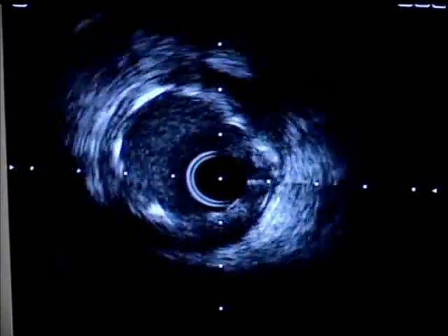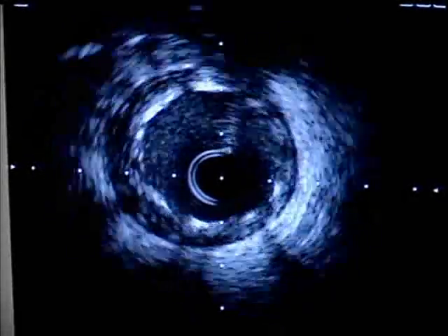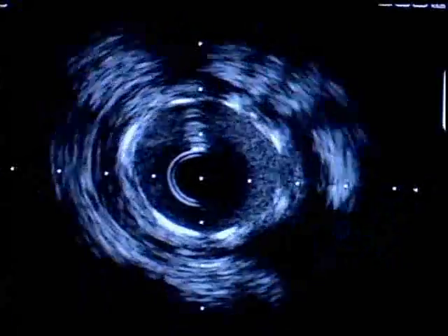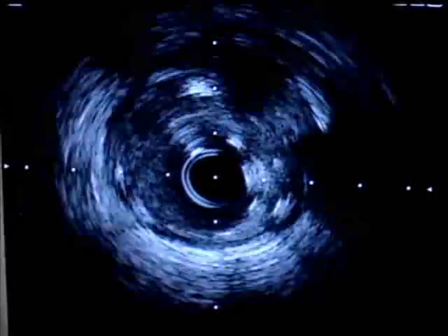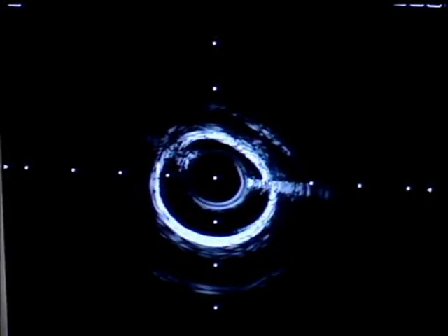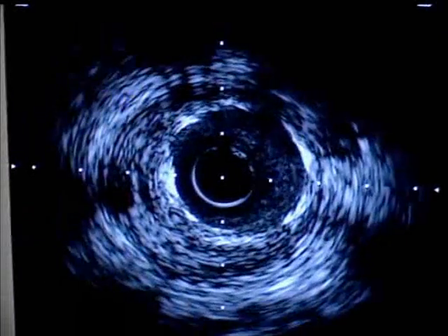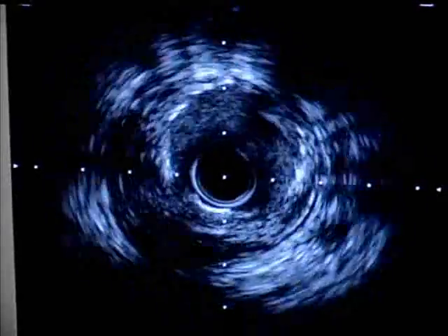One could slightly expand that even a little more on the circumflex, but that's at the edge, at that distal portion. So now let's see the ostium. Is it touching the wall? Now you can see here, and that is how basically these two dumbbells will look. Okay. We are now in the LAD. From what you have seen with the IVUS so far, you're happy with the carina there? Yes. Okay, we're coming back.